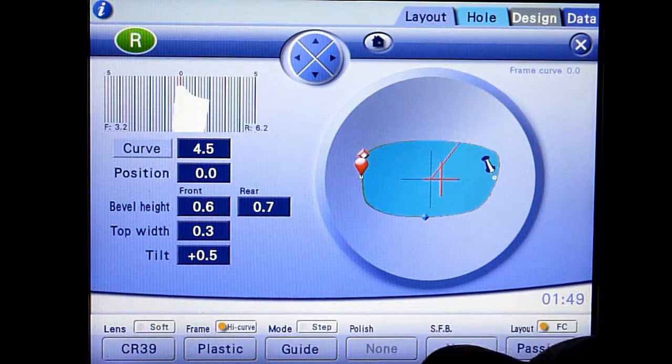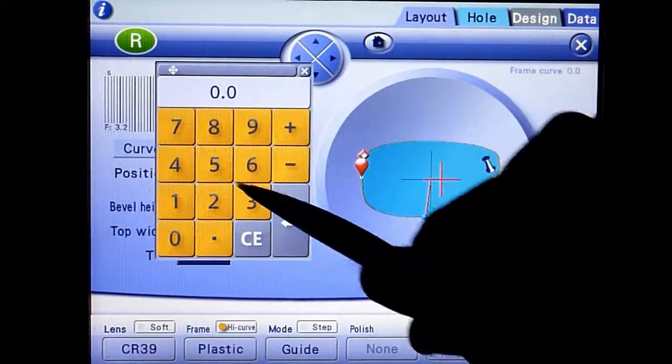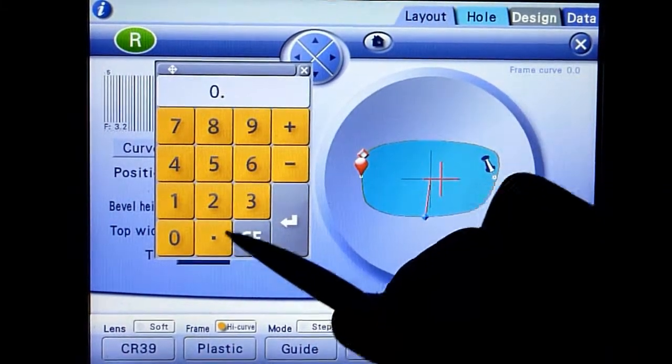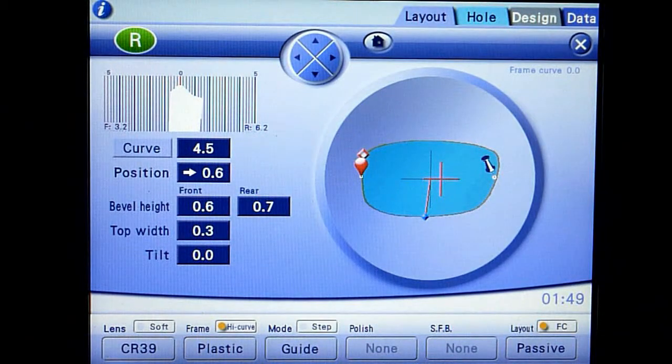Adjust the curve, tilt, or position values to get the optimal bevel placement result.